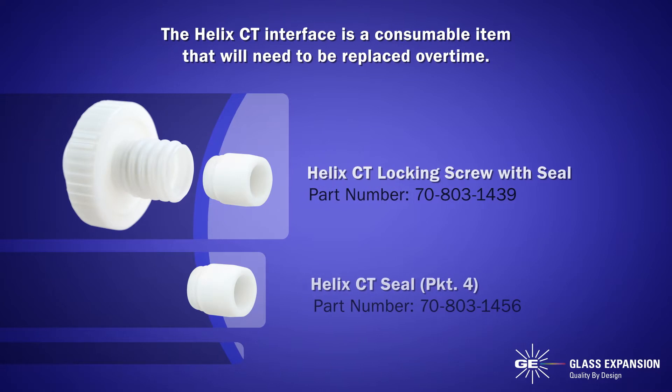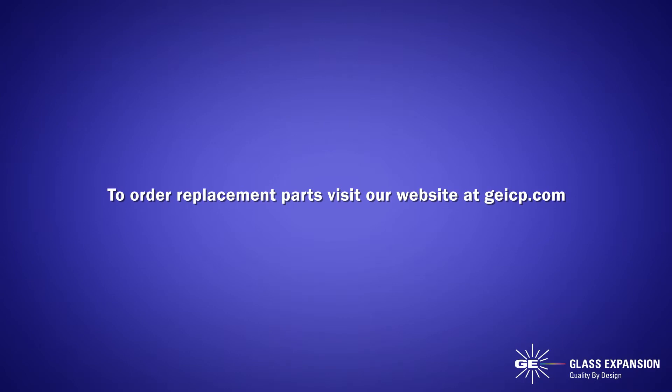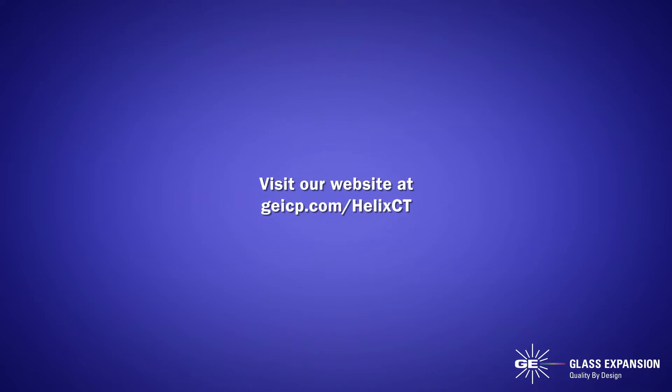The Helix CT interface is a consumable item that will need to be replaced over time. To order replacement parts, visit our website at geicp.com. If you have any further questions about the new Helix CT, visit our website at geicp.com/HelixCT.